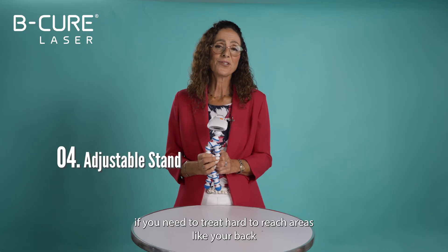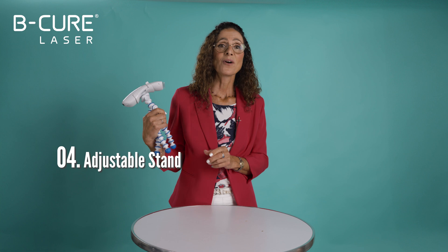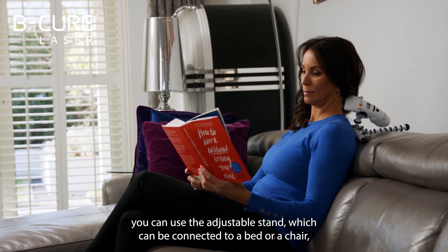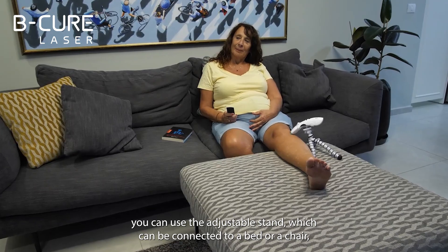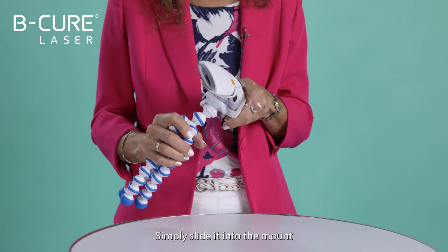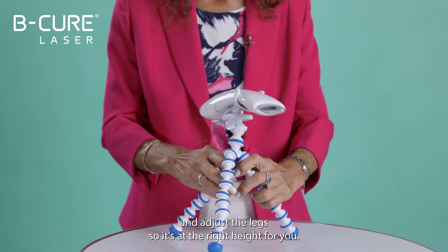If you need to treat hard-to-reach areas like your back, or just want to perform the treatment more conveniently, you can use the adjustable stand which can be connected to a bed or a chair so you don't need to hold the device. Simply slide it into the mount and adjust the legs so it's at the right height for you.